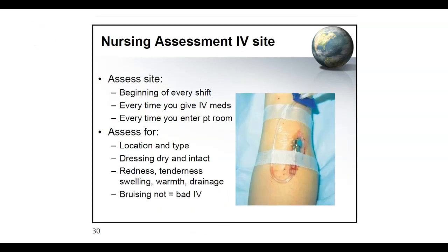All right, so once you have a patient that has an IV site, make sure that you are assessing the site. That's part of your assessment. So assess the area every shift, every time you give those medications, and every time you enter the room. There's nothing wrong when you're already there anyway. Every time you're doing a focus assessment, do that, right? Take a look at it, especially those patients who are sick and have a tendency to have their IVs infiltrate. So what are you looking for?